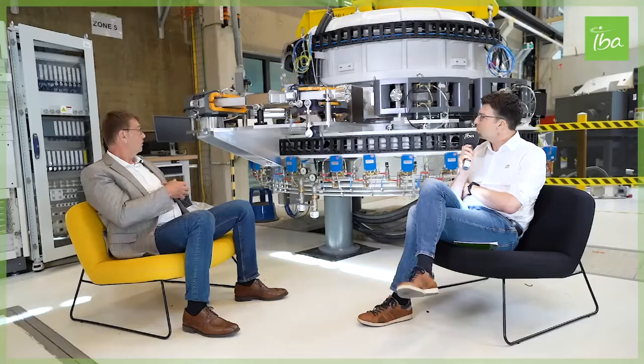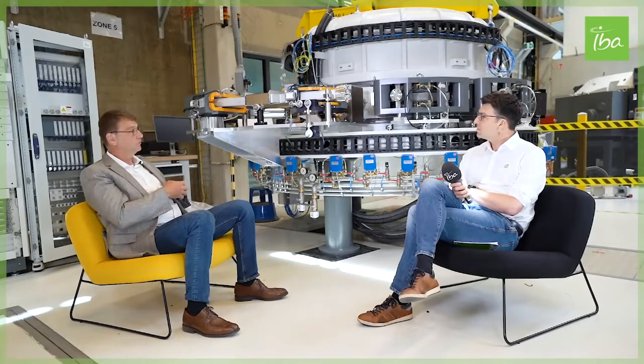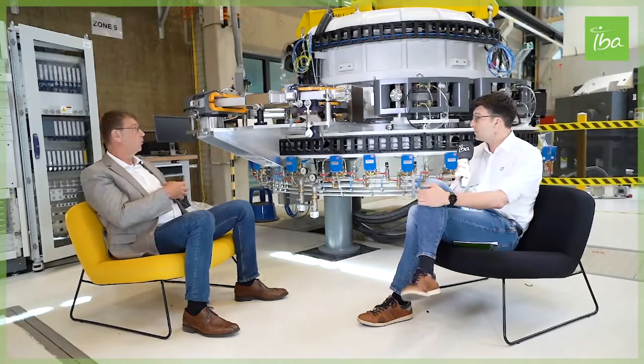Is it something complex, this magnet? It looks complex. No, it's not. It's a simple magnet, just a big one to make more room. It's a low power magnet. It's actually more tolerant than a small magnet, because of the achromaticity of the magnet.